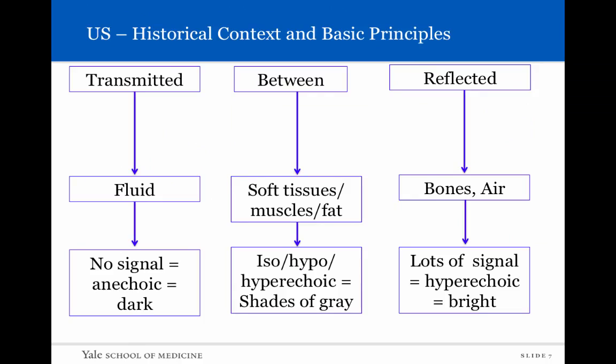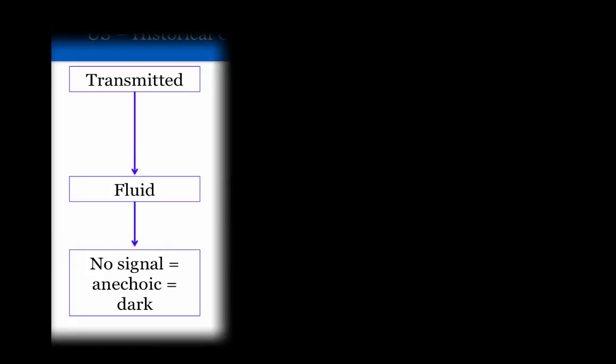And so if we go back to the concept of the sound waves interacting with the different tissues, as we mentioned, they can be completely transmitted through that tissue, they could be completely reflected, or often something in between. Now if something's made up of pure fluid, it turns out the sound waves will go directly through that fluid-filled structure.